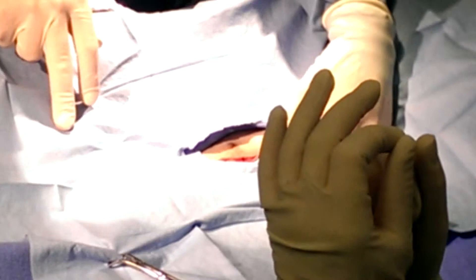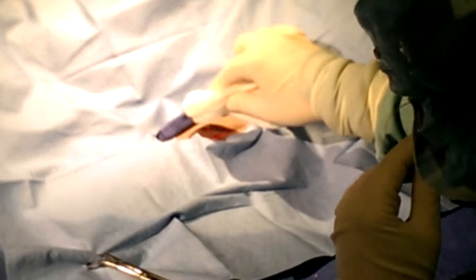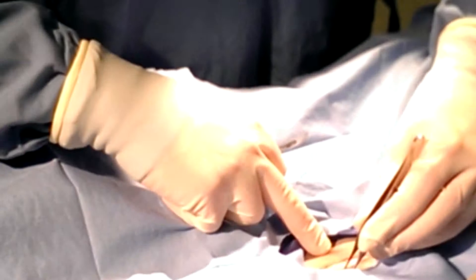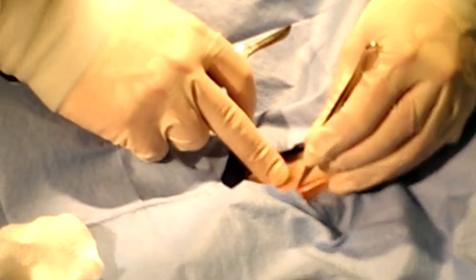It looks like it might be double-wrapped. If it's double-wrapped, you can put it on the instrument stand and open it flat. Pull your sponges out, put them on the table, get rid of the packaging. Remember, we blot — we don't wipe. I'm pressing firmly because I don't want to wipe but I really don't want to suck it up. As capillaries leak, we'll look for it. I'm just looking for the linea, and I can see it right there — that's my target.